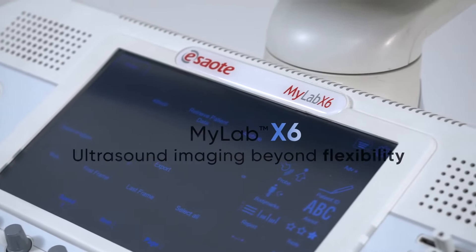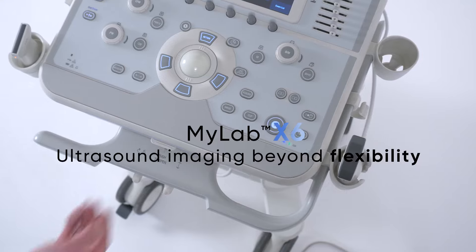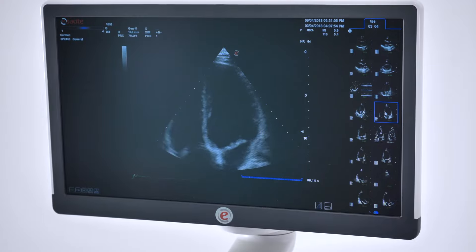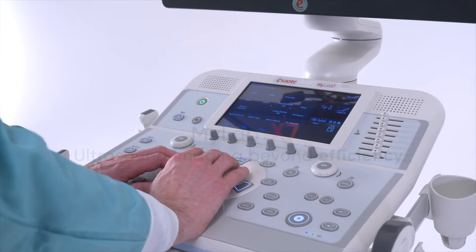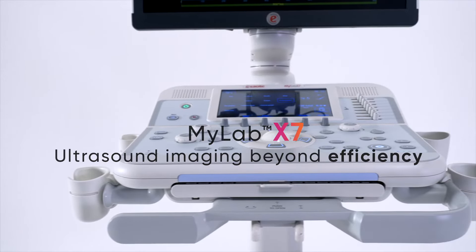ESAOTE MyLab X6 — Ultrasound Imaging Beyond Flexibility. ESAOTE MyLab X6 — Ultrasound Imaging Beyond Efficiency.